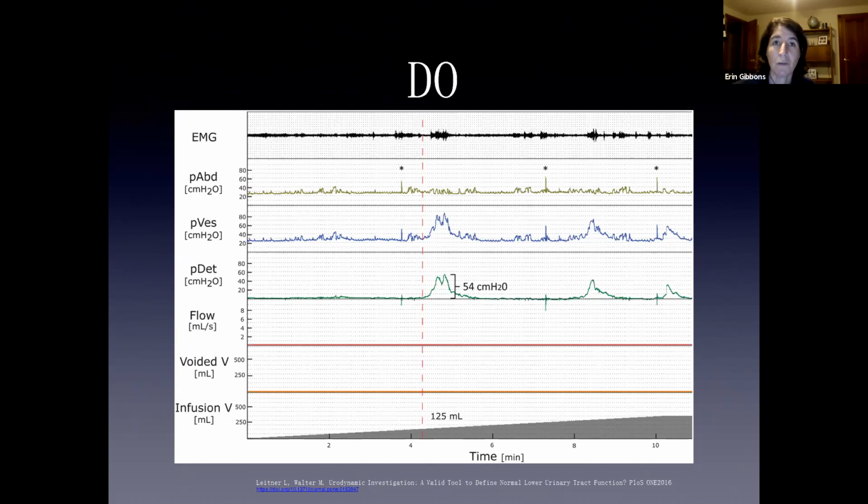The important ones, obviously, you can use it for women who are going to have a stress incontinence procedure, but you're probably already doing those procedures very well without urodynamic data ahead of time. It's helpful maybe in the woman who already had a stress incontinence procedure and is now having issues, or has had several procedures, 20 years ago and 15 years ago, and now has leakage or new leakage. Maybe study that woman before you do a third stress incontinence procedure on her 20 years later.